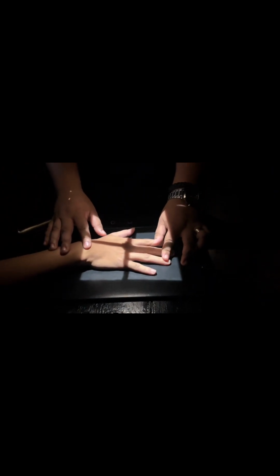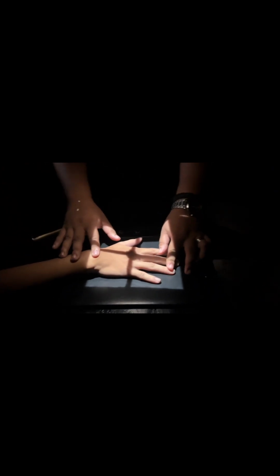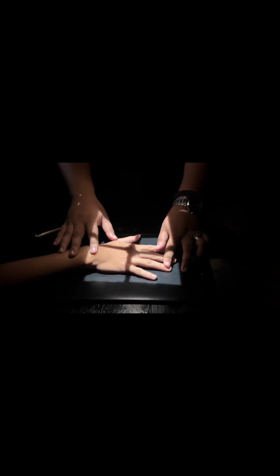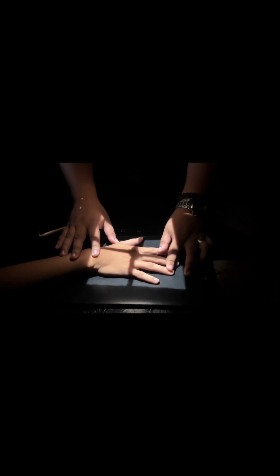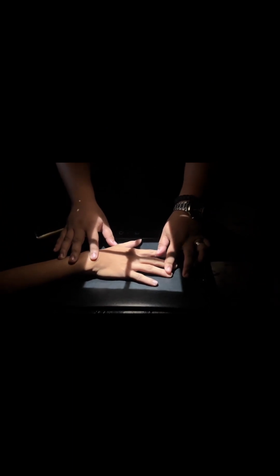So next is the hand routine. So I'll be demonstrating the PA projection first. So sit patient at the end of the table with hand and forearm extended. The clinical indication for this is fractures, dislocations, and foreign bodies of the phalanges, metacarpals, and all joints of the hand. Second is pathologic process such as osteoporosis and osteoarthritis.